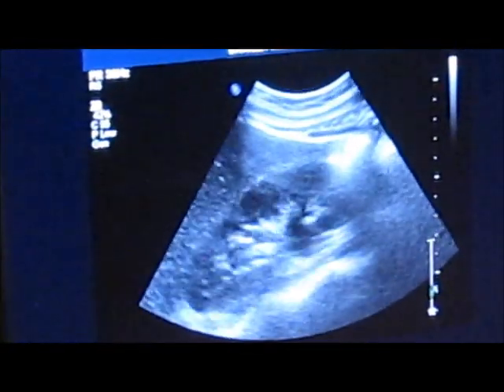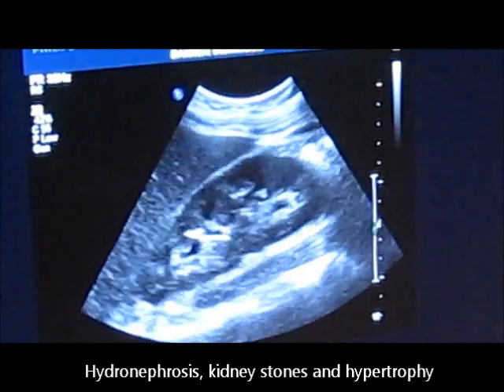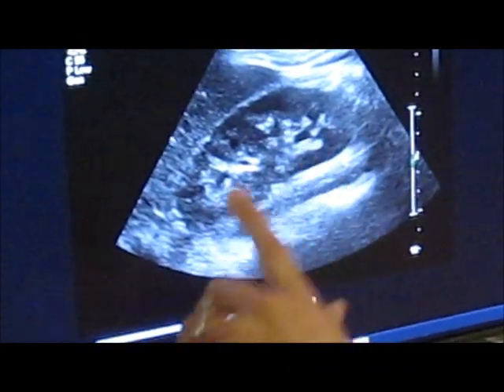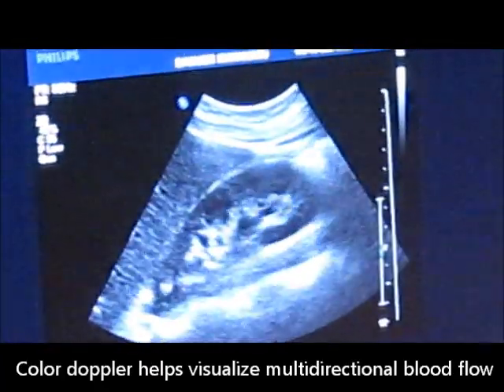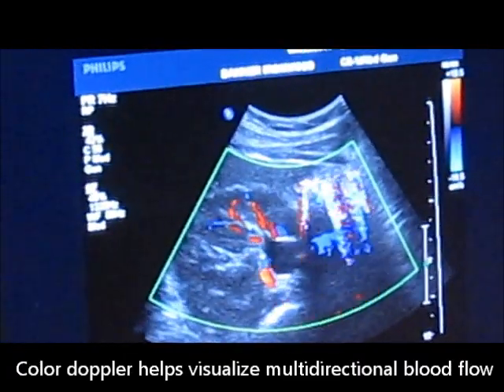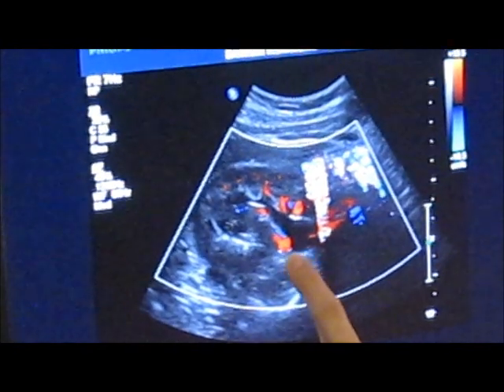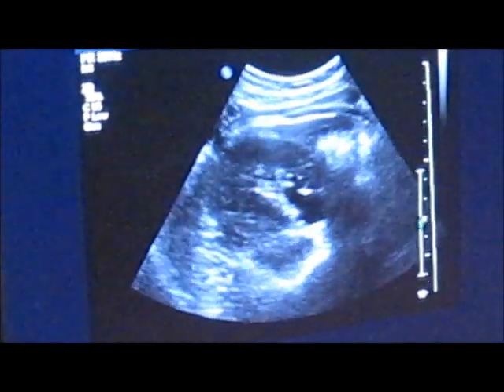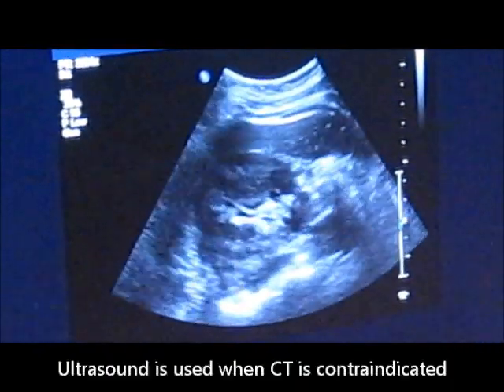Two other structures we look for in the belly are the kidneys, right and left kidney. So the right kidney is going to sit below the liver. It's kind of kidney bean shaped, just like the kidney beans you eat. This is the kidney here. When we put the color on, it just shows where all the blood vessels are within the kidney. You can see there's a lot of blood vessels. So you'll have main arteries and veins going in, the renal vein and main renal artery that come off the aorta and the IVC into the middle of the kidney. People can get kidney stones. Most commonly they order a CAT scan for kidney stones, but if the patient's pregnant or the patient's allergic to the CT contrast, they'll order an ultrasound.